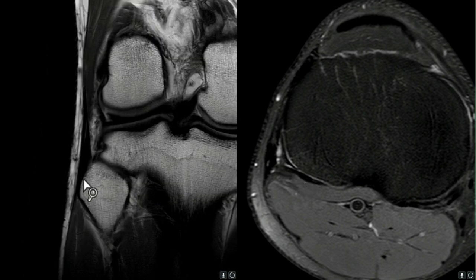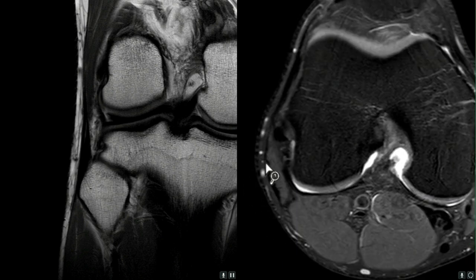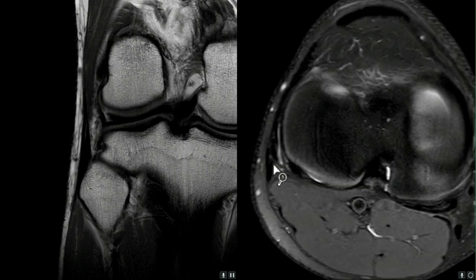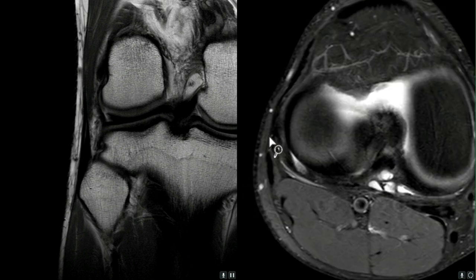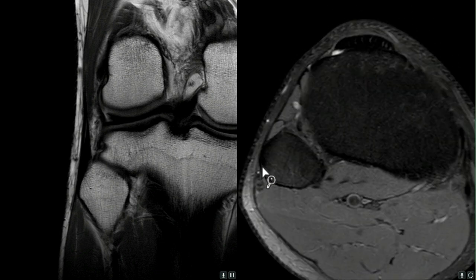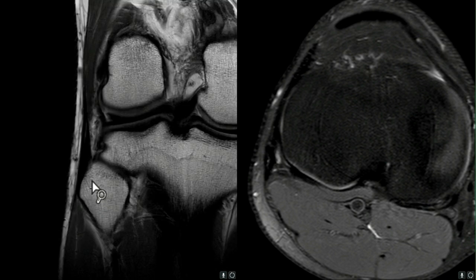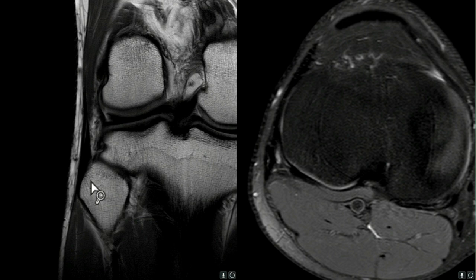The next structure is the biceps femoris tendon, which runs down here also inserting onto the lateral aspect of the fibular head. It sometimes joins the lateral collateral ligament and they insert together as one structure. On axials you can see the biceps femoris tendon running down in close proximity to the lateral collateral ligament, and they both insert in this region. Anatomically the biceps femoris tendon has different portions which are not easily identifiable on MR imaging, so I won't go into too much detail here.